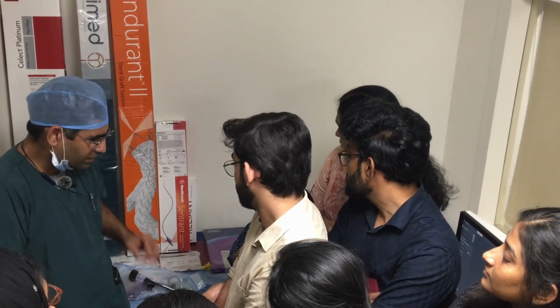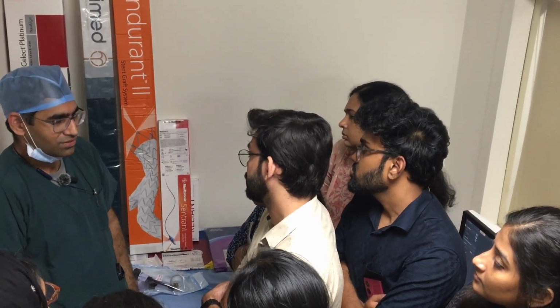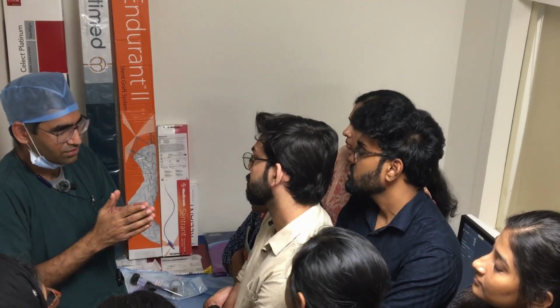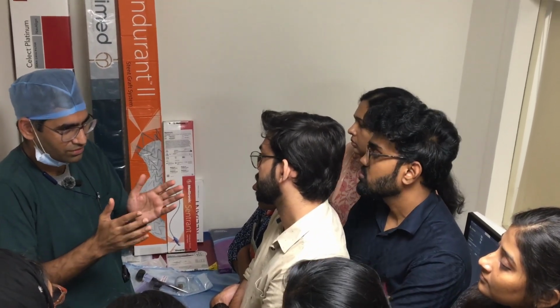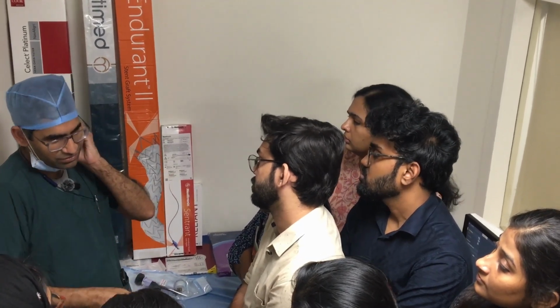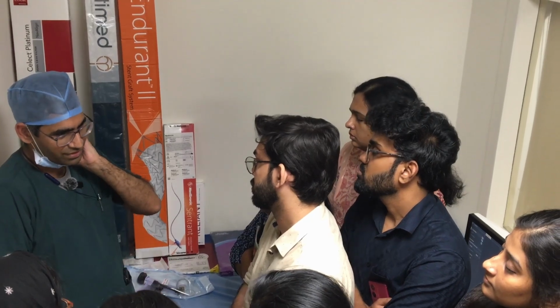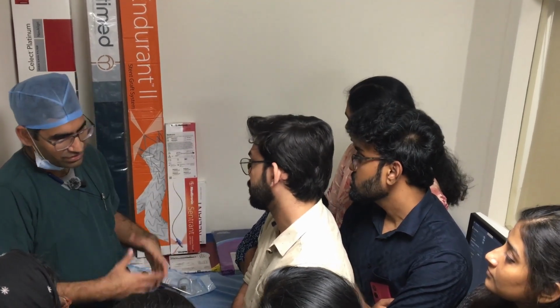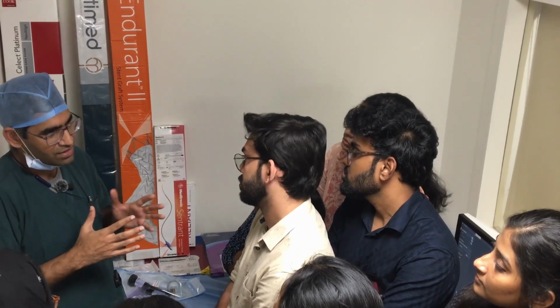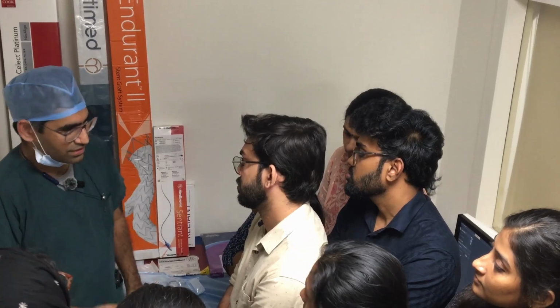Where you need balloon expandable is where you want very precise deployment. Your deployment has to be within a millimeter. It will not deploy on its own. You have a balloon, you can inflate the balloon where you want it. It will go and stick there. It will not move. It will not expand even 1 millimeter on its own. Whatever you do with it, it will remain like that. Self-expanding stents are not like that. If you leave it over time, it will come back. They are supposed to come back. So it depends on the vessel, how much radial force it has.